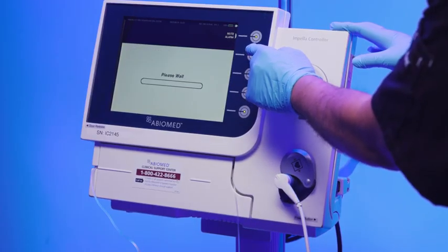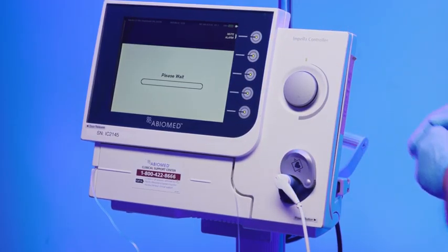Press start to begin the procedure. A blue progress bar will appear while the automated Impella controller primes the system. Once completed, the AIC will automatically advance to the next screen.